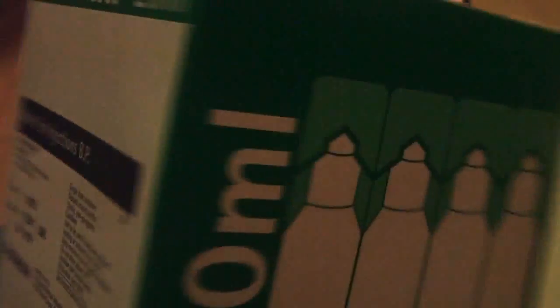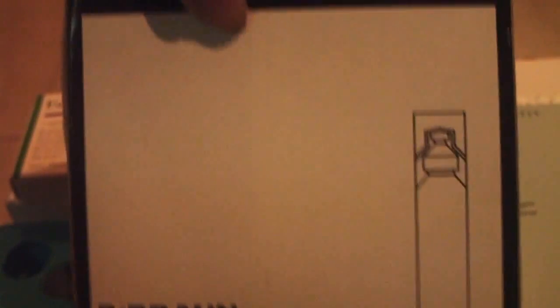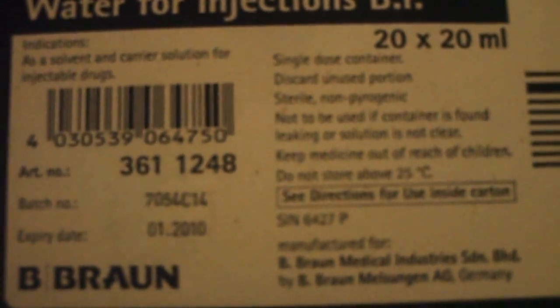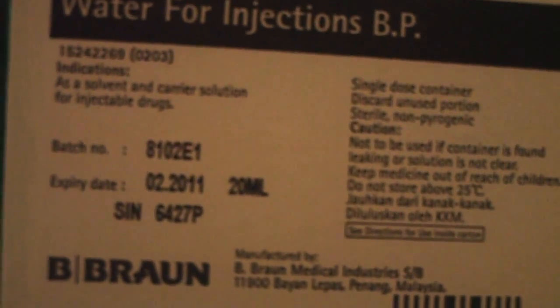Let's put that aside. For the water injection I use two brands — they're the same though. Both have black casing but different manufacturers. You can see the specs: 20x20ml. Some of the box is still wrapped just to keep it for reference. This other one is also 20ml — same, just different manufacturer, different expiry date and barcodes.